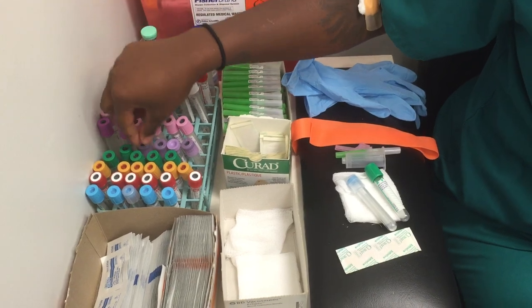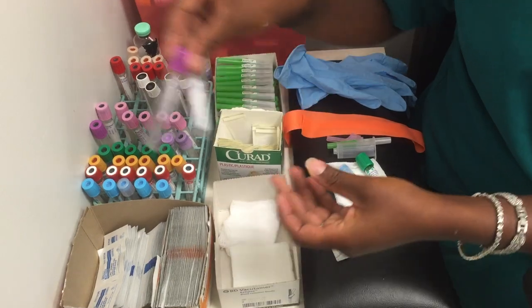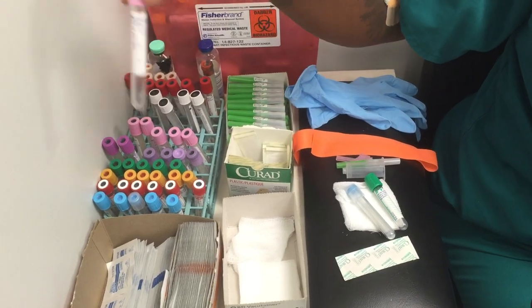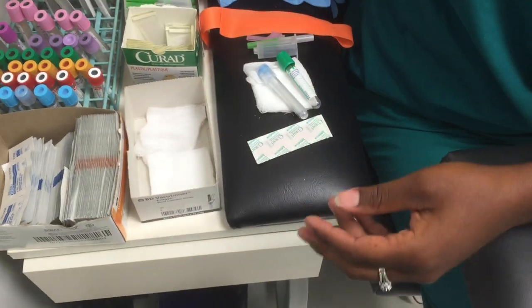Next, we have a lavender top tube. These tubes have EDTA in them and they are going to hematology. Next on the order of draw, we have a pink top tube and these will usually have EDTA in them as well.